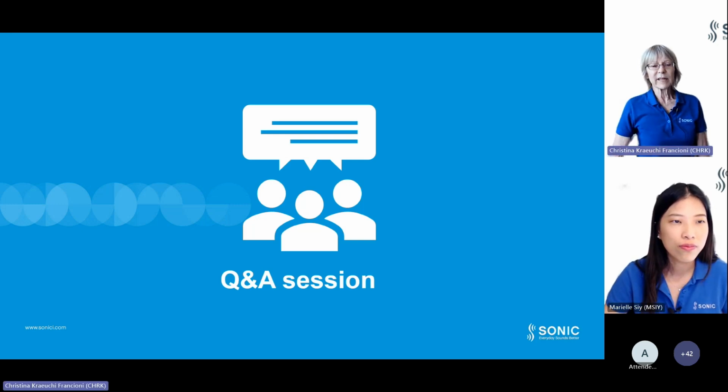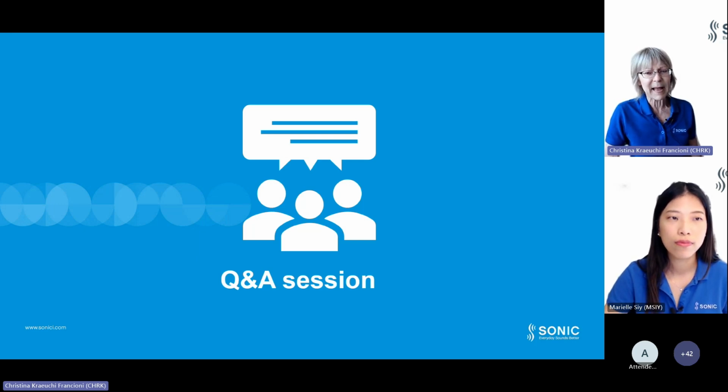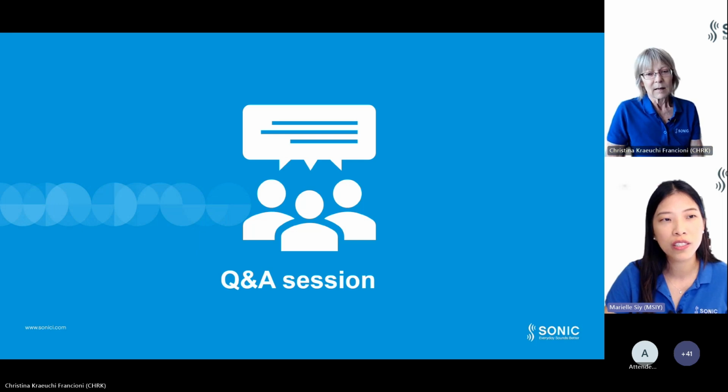So I'm just wondering if this question also includes the setting in the software. Because in the software, we can increase the volume 9 decibel max. So it would be interesting to know if this statement also includes the maximum adjustment in the software. Yes, I totally agree, Christina.